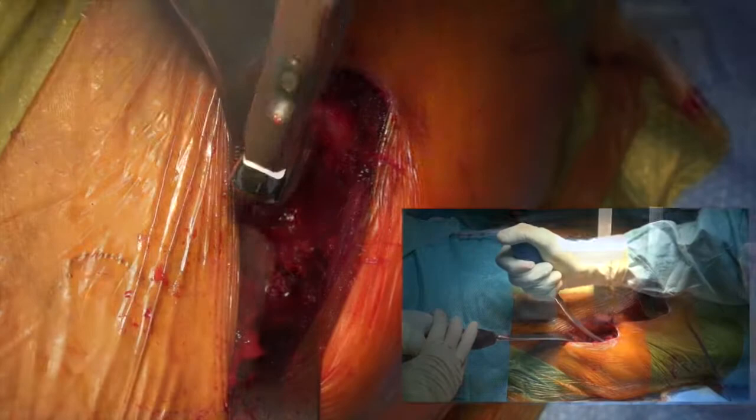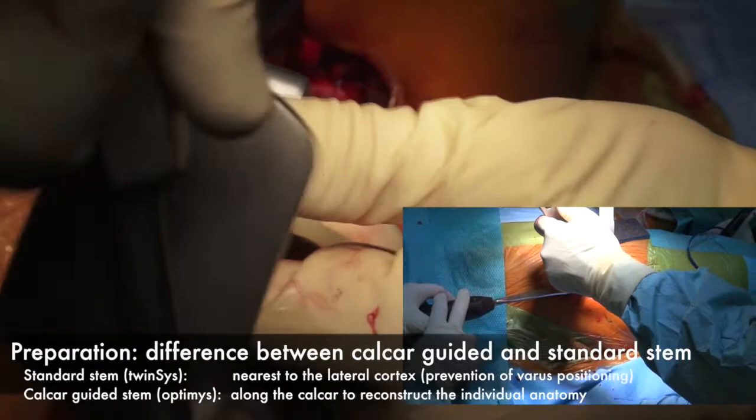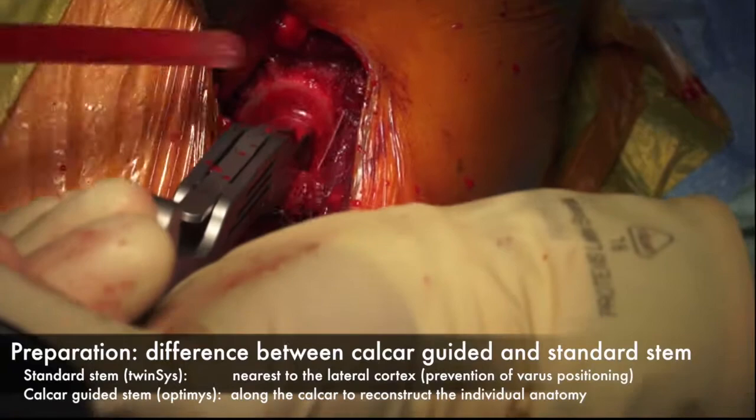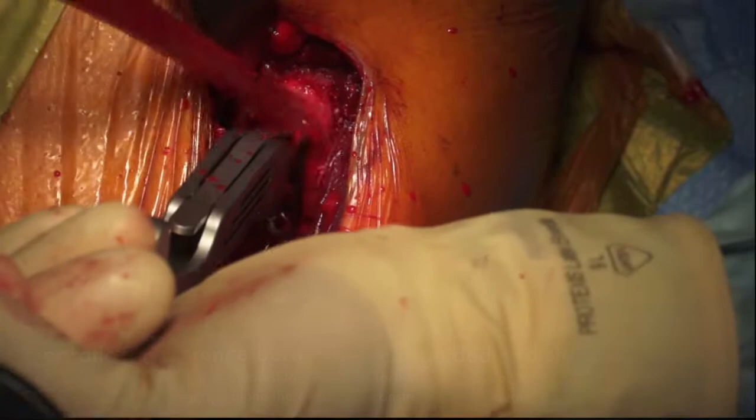Preparation. Difference between calcar guided and standard stem. Standard stem, Twinsys, nearest to the lateral cortex. Prevention of varus positioning. Calcar guided stem, Optimys, along the calcar to reconstruct the individual anatomy.